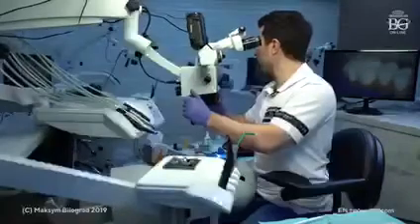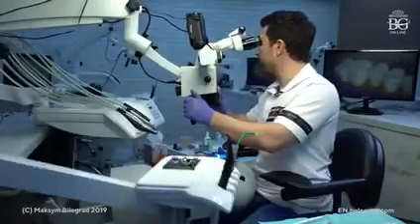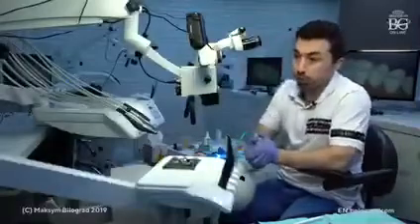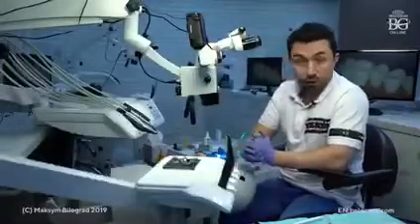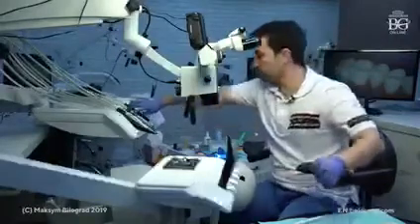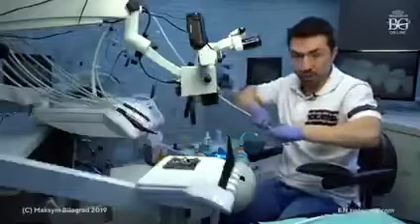for step 3, which will be disc, just to make all internal surfaces super smooth and to make our finish line perfect. Okay, so I'm changing my burrs, I'm changing handpieces actually.